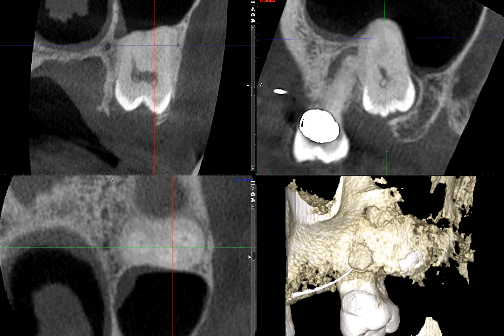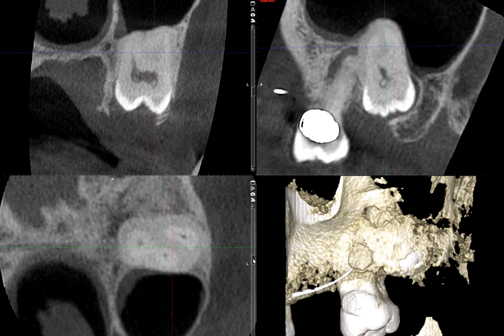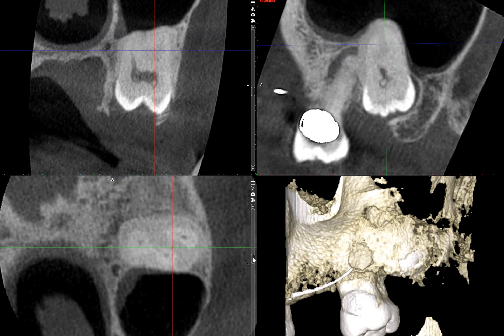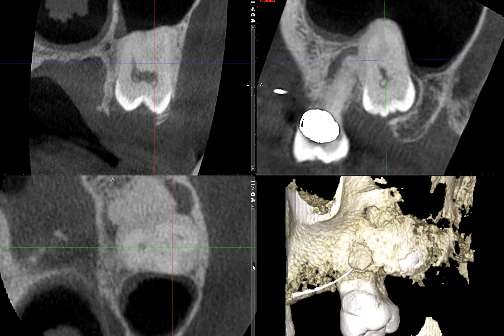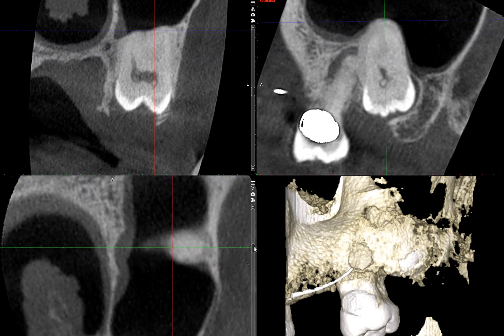So my question is: what is the condition or what is it that we're looking at here? What is the specific condition or case that we're looking at from this cone beam CT?